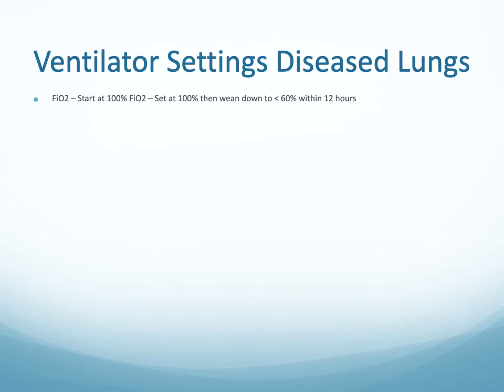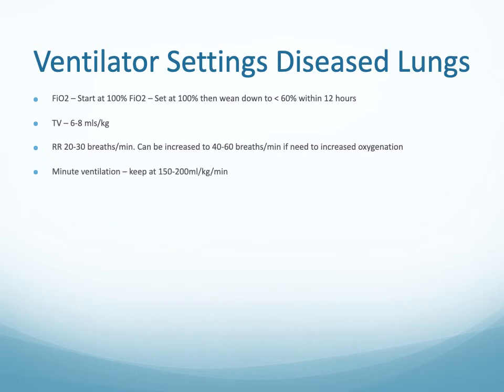Same as before, fraction of inspired oxygen starts at 100 and then very quickly drops to less than 60 within 12 hours. Tidal volume is less, so 6 to 8 mils per kilo, and your respiratory rate is going to be higher. It starts at 20 to 30 breaths per minute. You can go up to 40 to 60 if you need to increase the oxygenation.